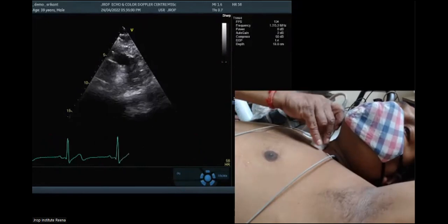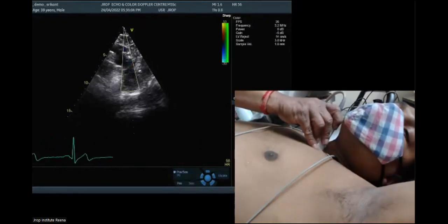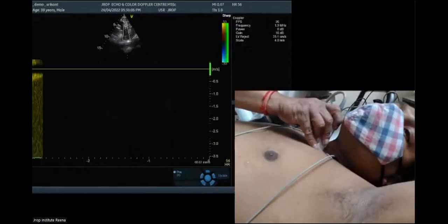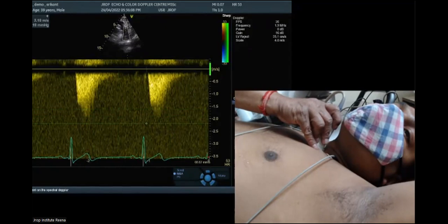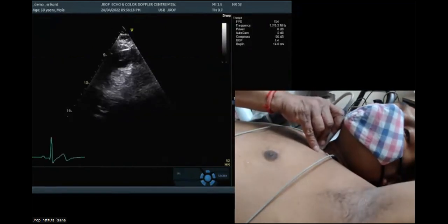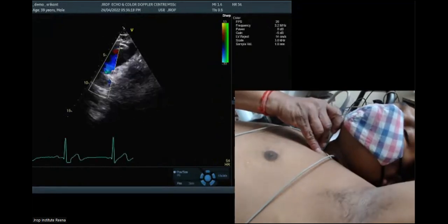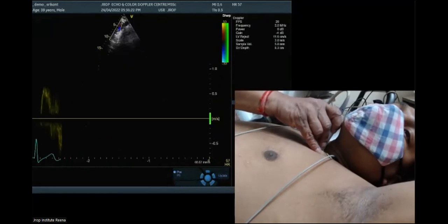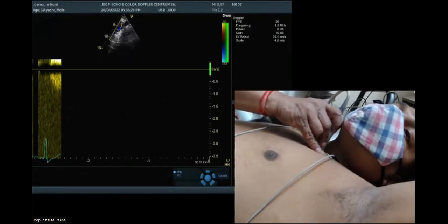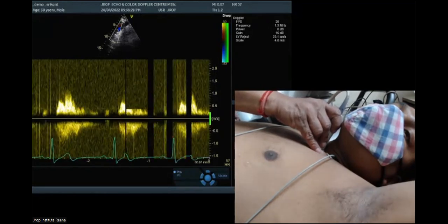Second important thing is, if you have to calculate the coarctation of aorta gradient, this is the one window where we do it. The flow velocity is almost 2 meters per second, insignificant. But this ascending aorta is very useful when we talk of the various gradients across the various windows, and we can look at gradients of aortic flow in this suprasternal window.